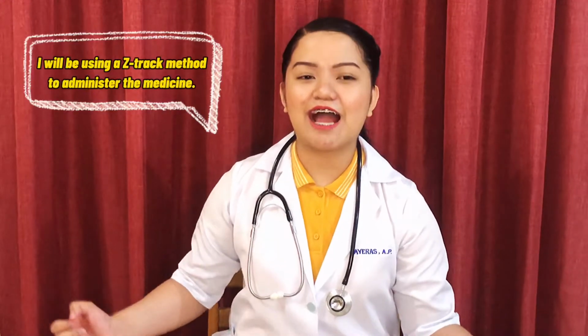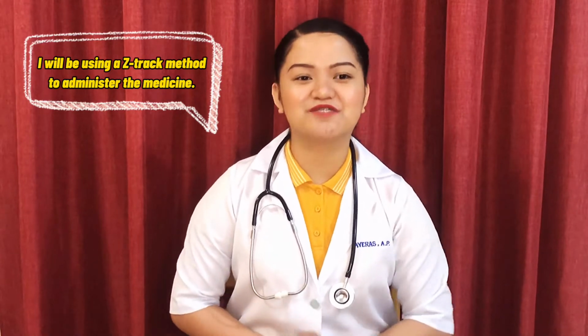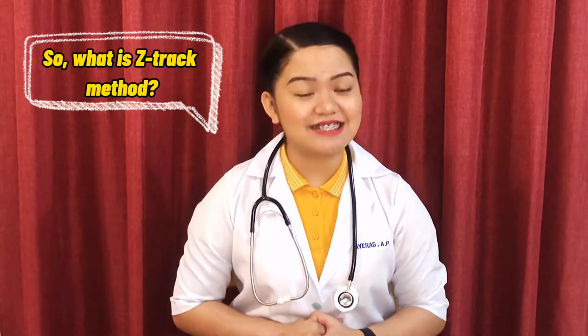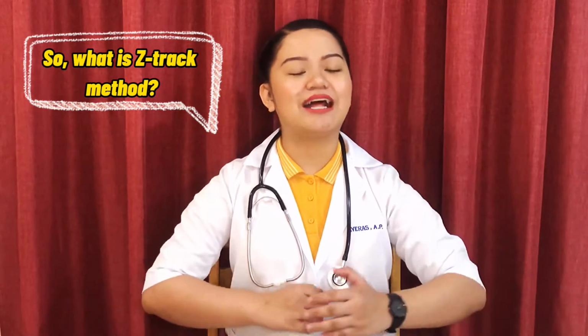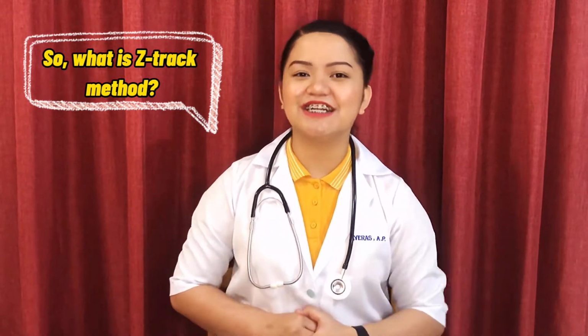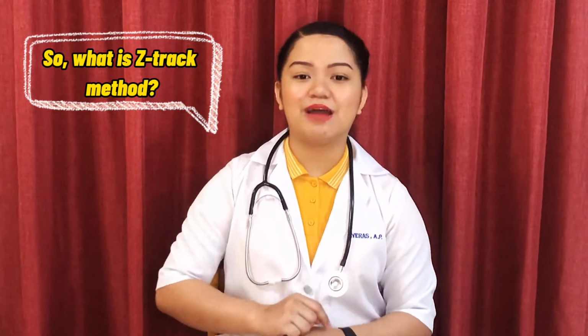Common sites are the ventrogluteal, vastus lateralis, and the deltoid muscle. Here, I will be using the Z-track method to administer the medicine. So, what is the Z-track method? The Z-track technique is a method of administering an IM or intramuscular injection that prevents the medication from being trapped in the subcutaneous tissue, sealing the medication in the muscle and minimizing irritation from the medication.